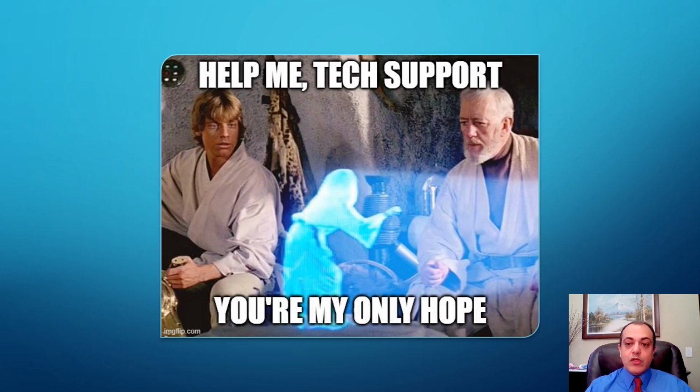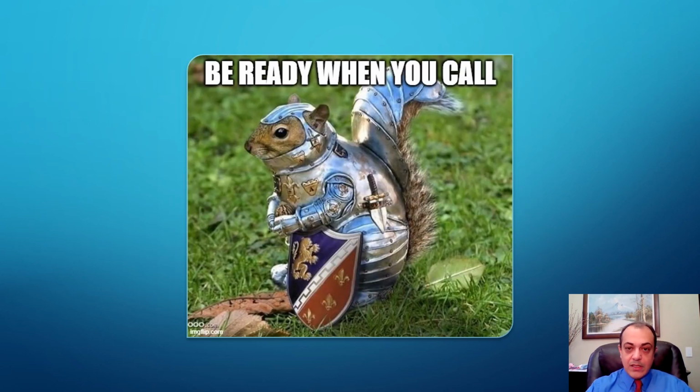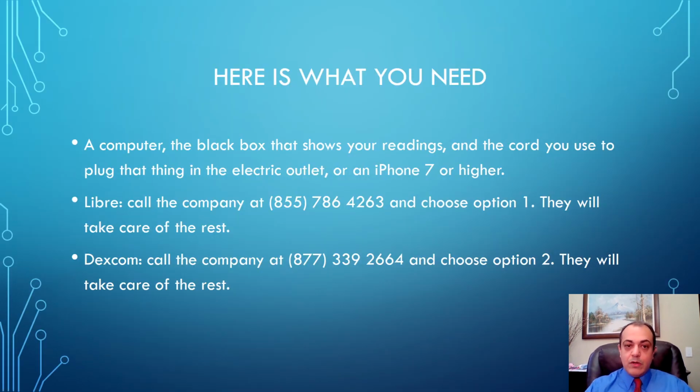How do you do that? You need the tech support to guide you through the steps. But in order for the tech support to help you through the steps, you have to have everything ready. You need to be ready when you call, which means that there are certain items that you need to have available before you place that call. And here are the items: a computer, the black box that shows your readings, and the cord you use to plug that thing into the electrical outlet, or an iPhone 7 or higher.